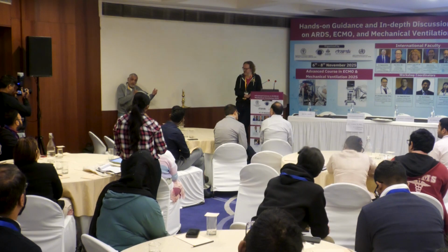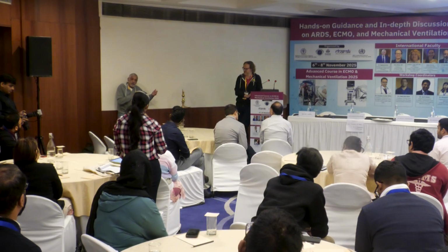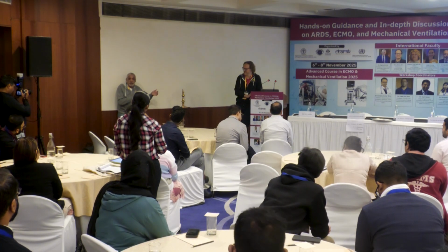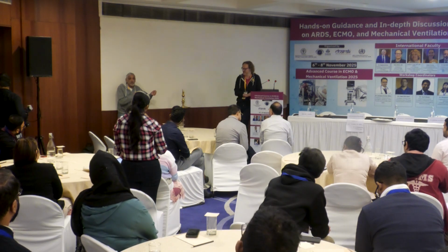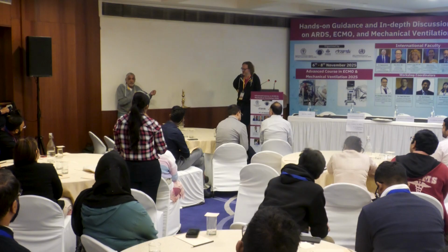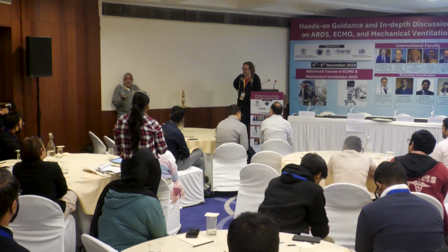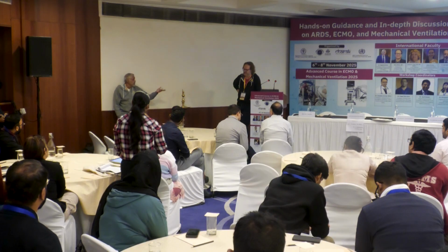Sometimes what we will do is leave the cannula, get an X-ray, and then gently advance, but you have to be very careful. There are times when we have advanced the catheter blindly, and we are perfect. So yes, there are people who look at cardiac echo at the bedside. He uses it very regularly. He showed me his technique.